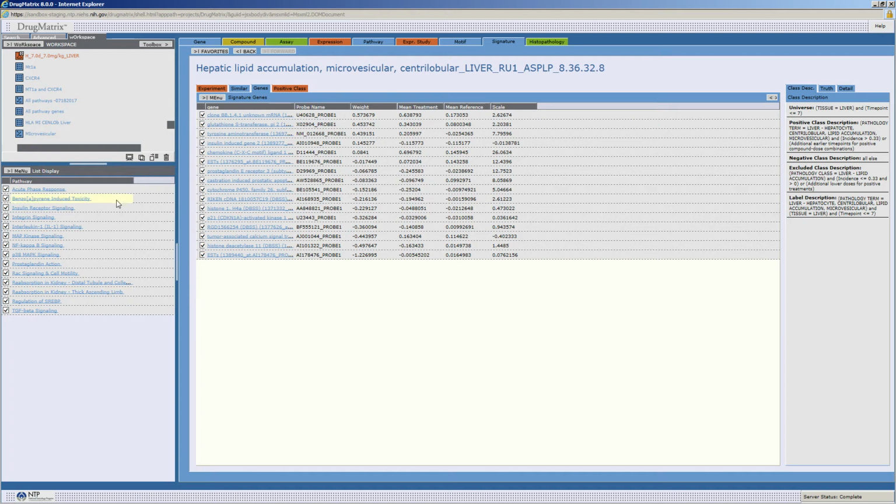So overall, pretty good. There are a number of other things that you can do in here. I just wanted to get you oriented to start off working with the interface. I'll make more videos to give you an idea of what else you can do. But again, the thing you probably want to do first is to actually look at the histopathology, and you can go to the study report. So that was one thing that I didn't show you.